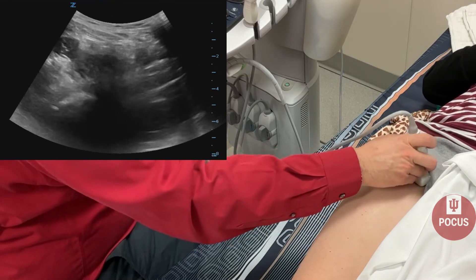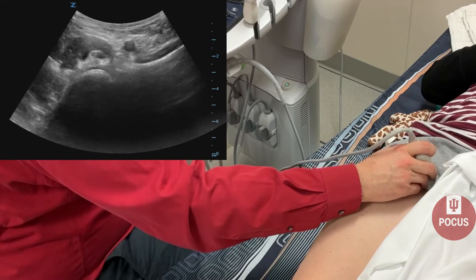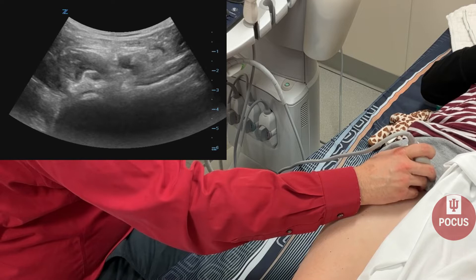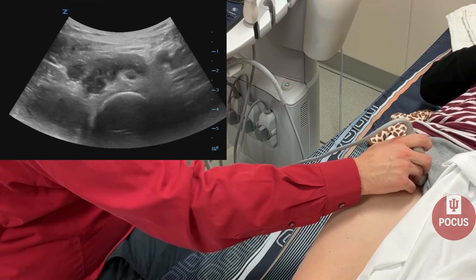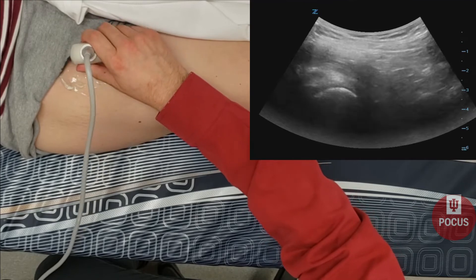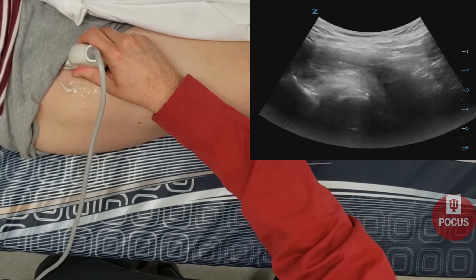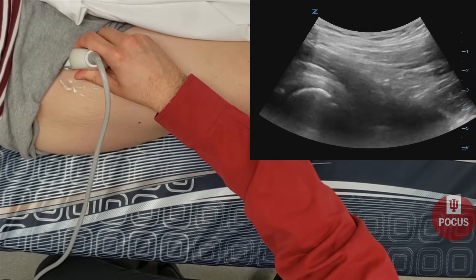As we come back to the hip joint, you can see the femoral artery and vein — we compress the vein here. We'll also see the iliopsoas muscle and tendon. You can rotate the probe and see the iliopsoas tendon as it goes over and across the hip joint.